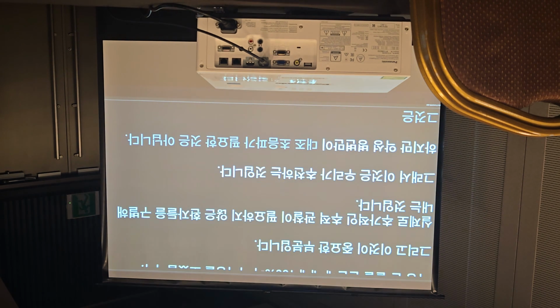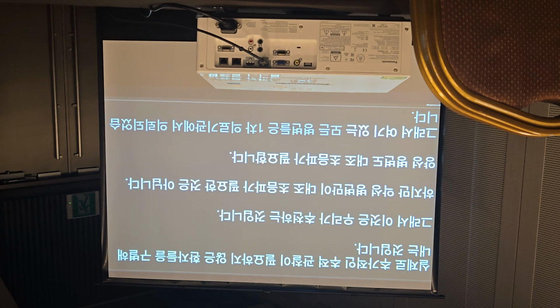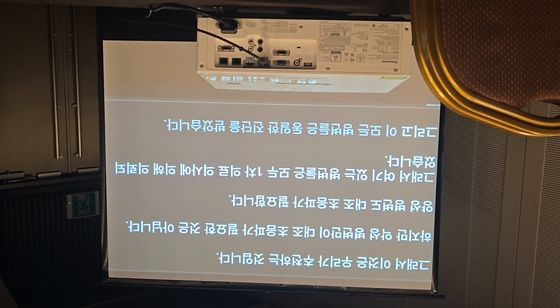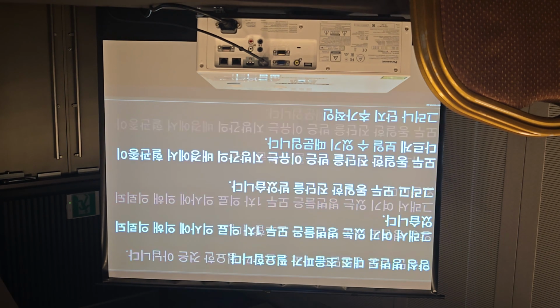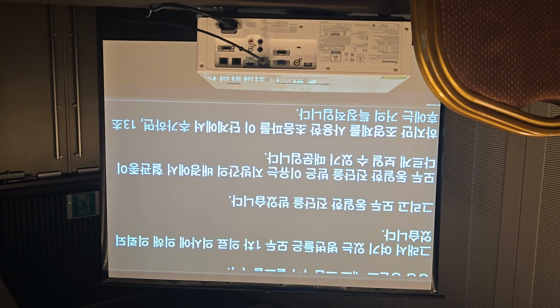So all of these lesions here have been referred by the primary healthcare physician, and they're all the same diagnosis, because on the background of the fatty liver, your hemangioma may look different. But just by adding contrast-enhanced ultrasound at this stage, it's almost pathognomonic after 13 seconds to see that globular enhancement and the infilling. So you have saved downstream costs in this patient.